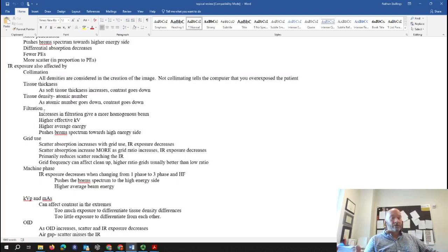So what we have to do, what Biomed has to do, is they have to get into the computer system or into the X-ray system and tweak it just a little bit to bring the output back up to where it should be. So in that context, filtration, keep in mind that if you add any filtration, it's going to absorb some of those low energy photons. Some of those photons might make it to the image receptor, and if they do make it to the image receptor, they expose it. It goes into the formulation of your index number. So as we increase filtration, the whole point to all that is as we increase filtration, you have to change your technique. So if you used a wedge filter, a compensating filter or something like that, you would have to change your technique. Specifically, you would want to increase your mAs.